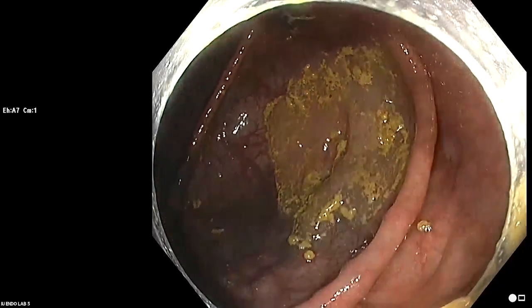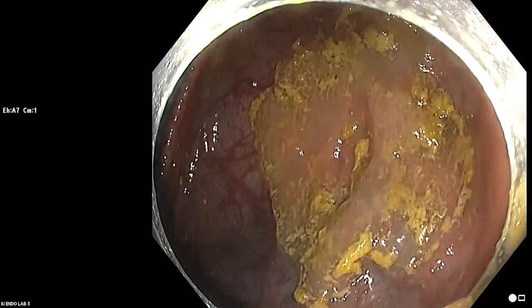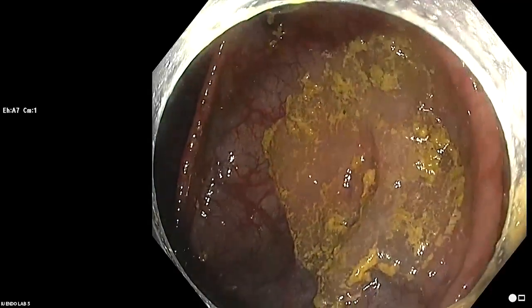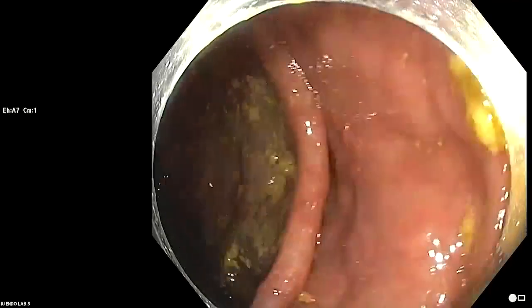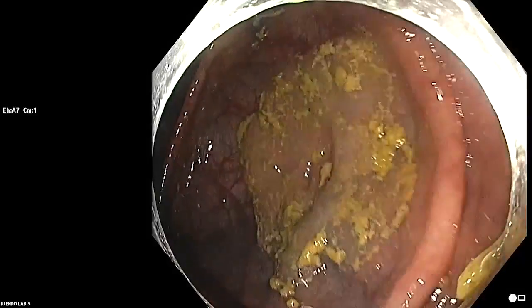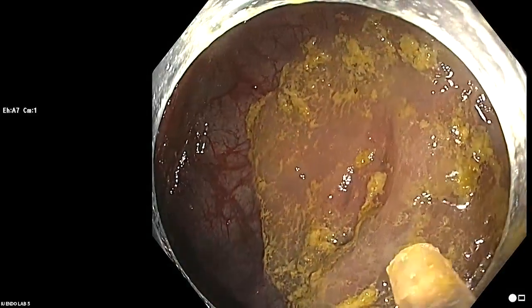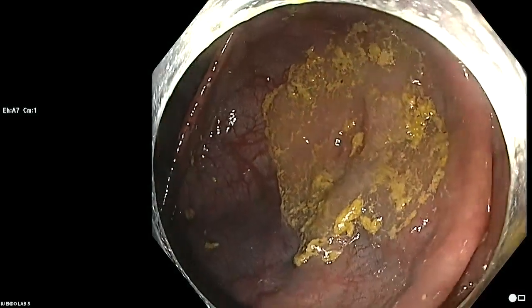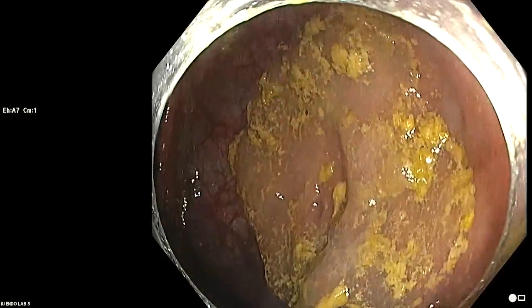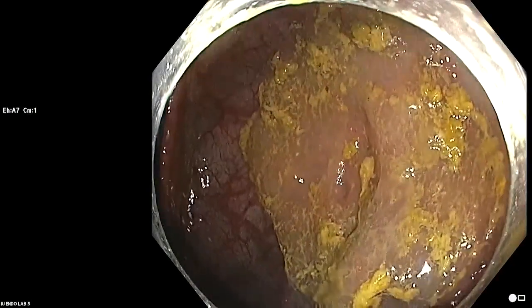Now, thoughts about that. One of the themes in the first half of the course is cold resection. The referring doctor removed everything hot, and it was all serrated. I don't know that it wouldn't have been safer and faster to do it all cold. I would say that the entire spectrum of serrated disease can now be removed without electrocautery.